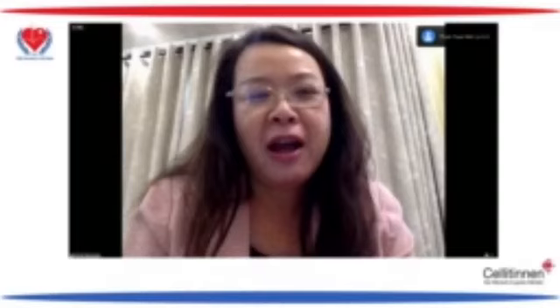Yeah, the RV-focused view, and you measure it at the end diastole. Maybe in 3D, if you have a good sight, you can do the septal and lateral measure.